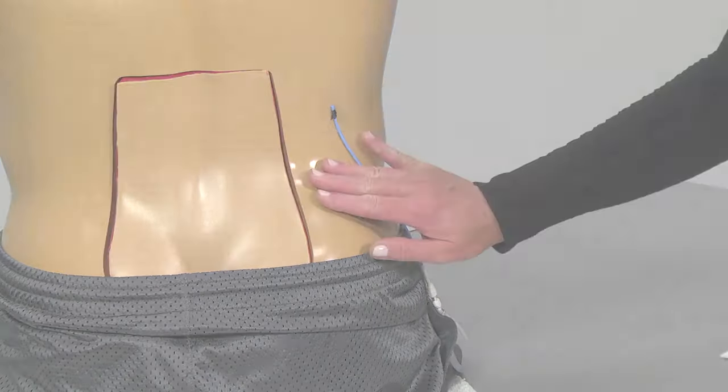Wash your hands or use hand sanitizer again. Gently wash around the tube with mild soap and water and pat dry. Be sure to remove all drainage to prevent irritation and protect your skin. Carefully place the dressing roll under the tube. This will help with discomfort and keep the tube from twisting at the insertion site.